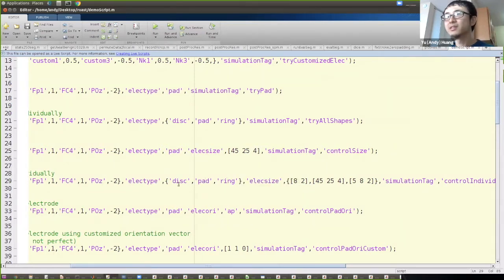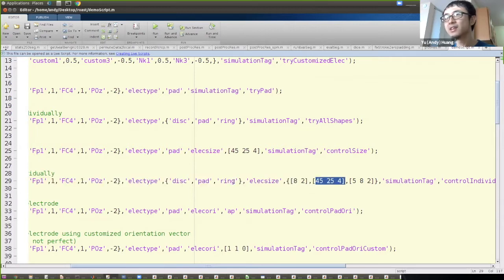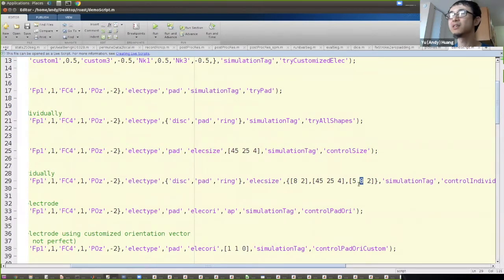You can configure electrode size using the electric size option. For a pad electrode, the size format specifies length, width, and thickness — for example, 45 mm long, 25 mm wide, and 4 mm thick. You can control size for each electrode individually: a disk electrode might have 8 mm radius and 2 mm thickness, a pad electrode has its own size, and a ring electrode has an inner radius of 5 mm, outer radius of 8 mm, and thickness of 2 mm.